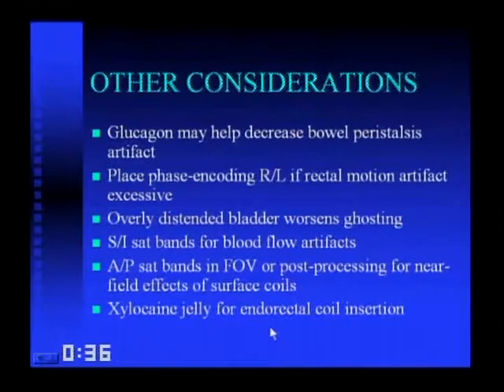We put superior and inferior SAT bands in place for the blood flow artifacts, and an anterior and posterior SAT band in the field of view on the subcutaneous fat will markedly decrease ghosting artifact and the effects of surface coils touching the subcutaneous fat. And I use xylocaine jelly liberally whenever I put in endorectal coils.